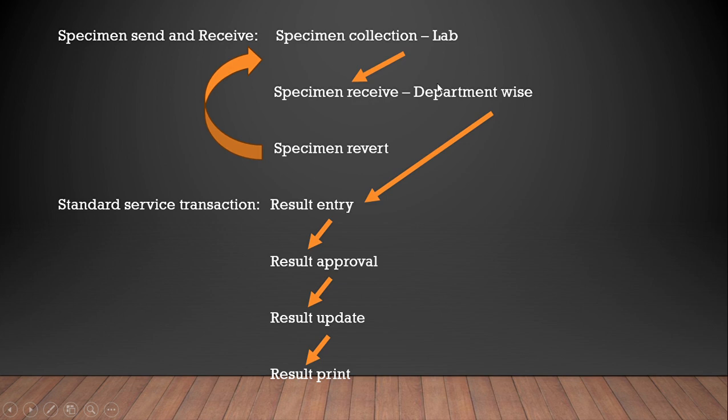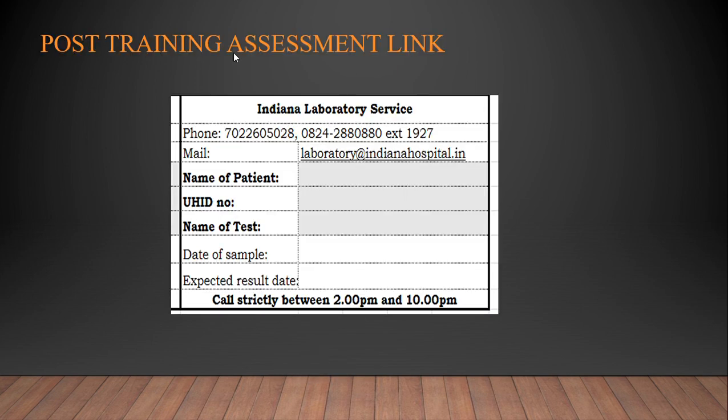You generate the barcode because the sample is already collected and has come in the vacutainers itself. So you don't have to collect, you just have to receive it again from the department so that it comes to result entry. But always remember there are some rules in how to receive samples from IP patients, so that we will discuss in another video.